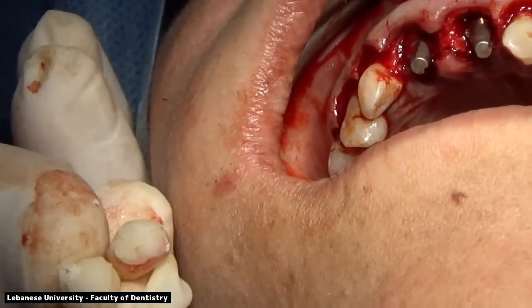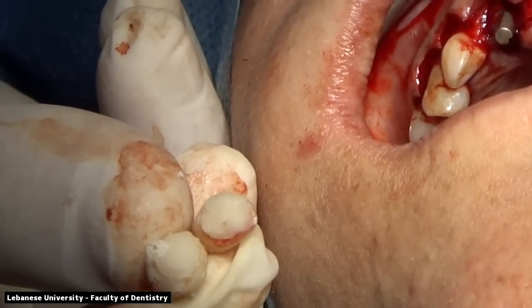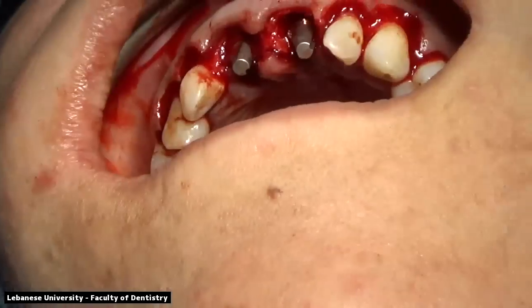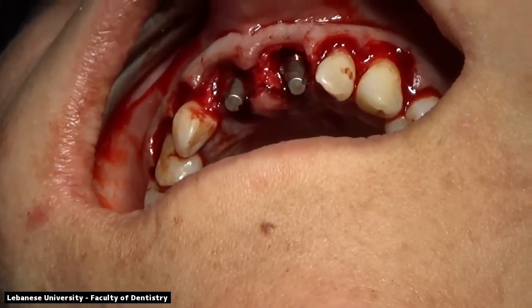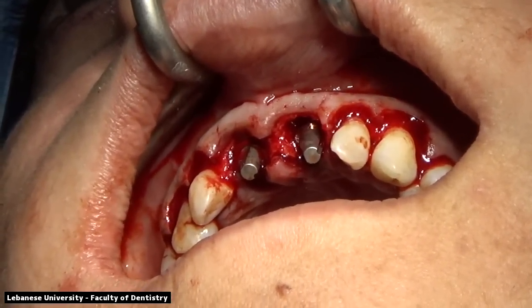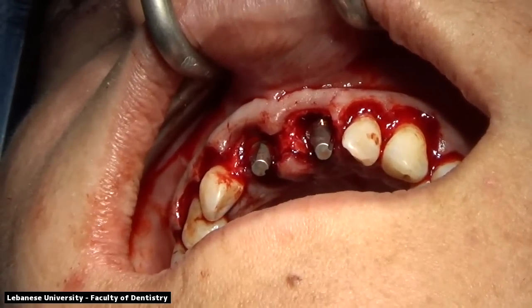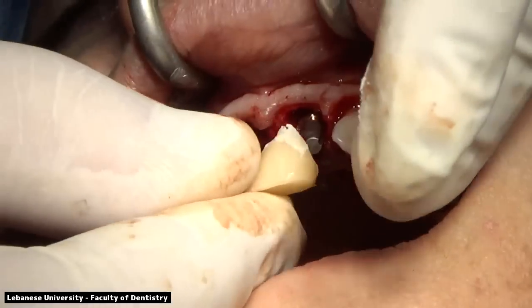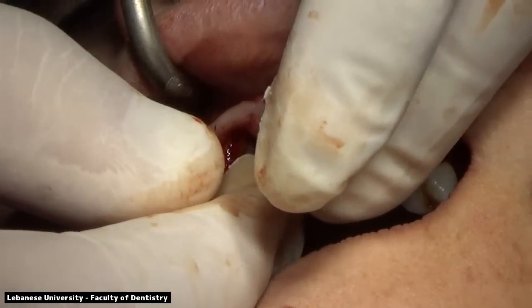Okay, you can appreciate the acrylic material that was placed and filled inside the shells of the two temporary restorations with a very thick consistency. We want it to be in a very thick consistency to model it to the shape that we want, and for it to set fast so that it can dry in a fast manner. We don't want it to stick to the area.